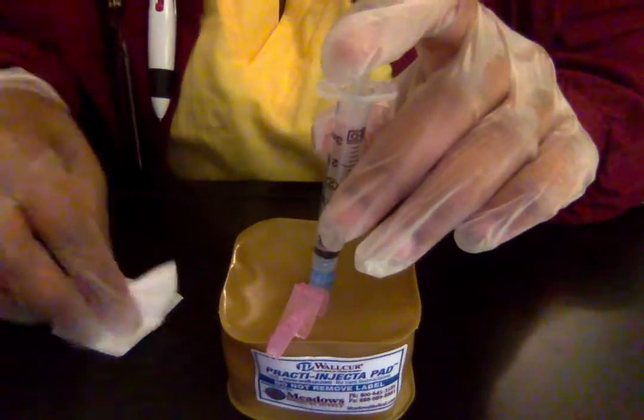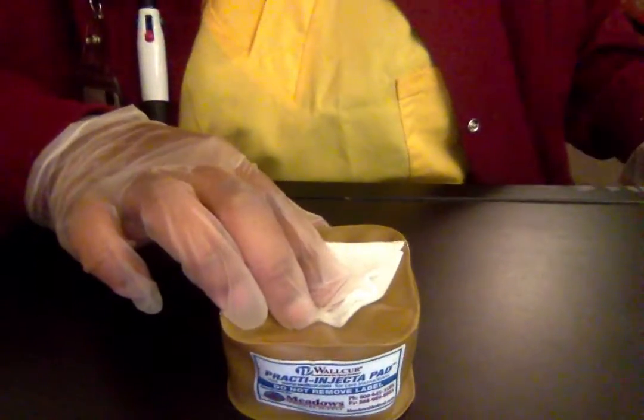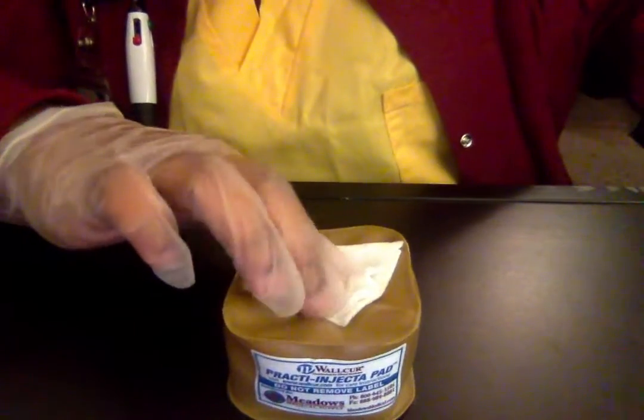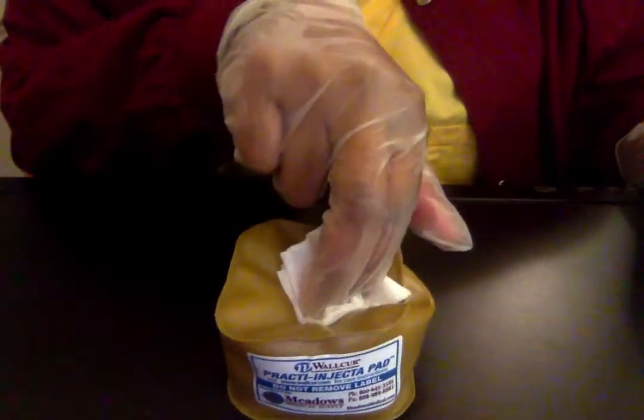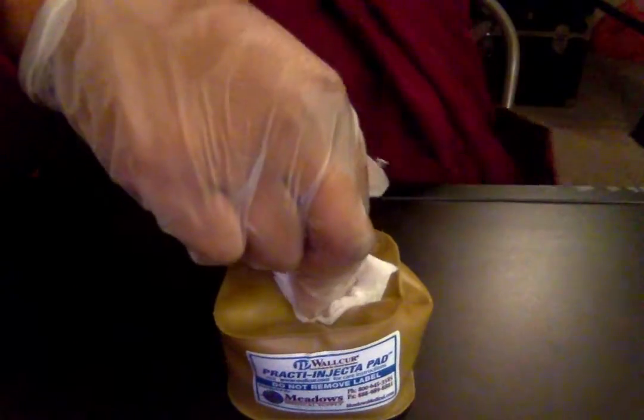And now that I have it inserted, I would take my gauze and just apply a little pressure. It might bleed a little bit, so I want to engage that safety mechanism on my needle also. I would just hold this for a little while, make sure there's no pain. It might create a little pain because we are in a muscle, but just make sure it's not really bad pain.